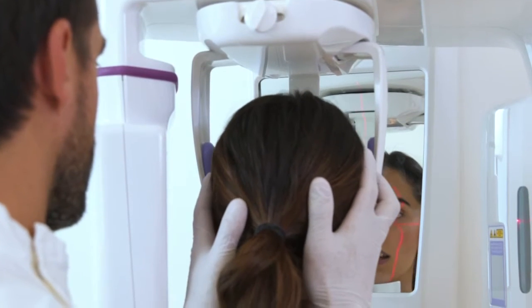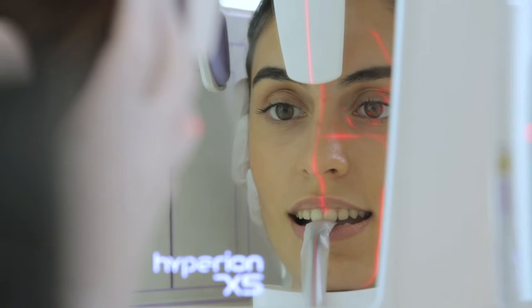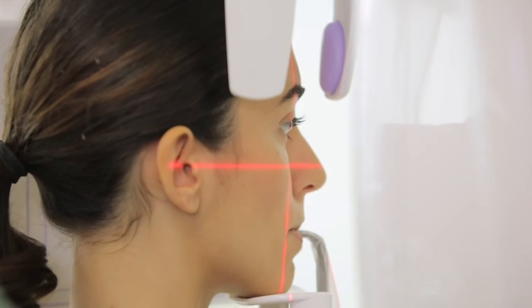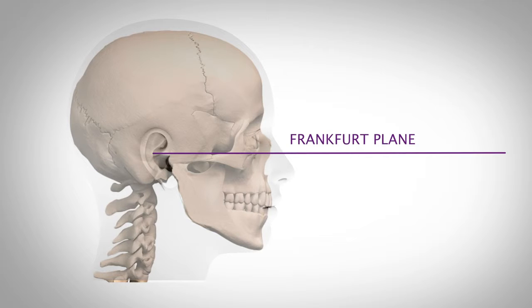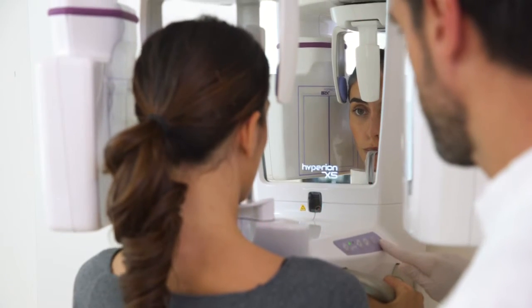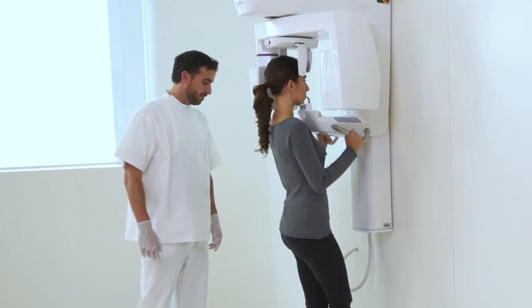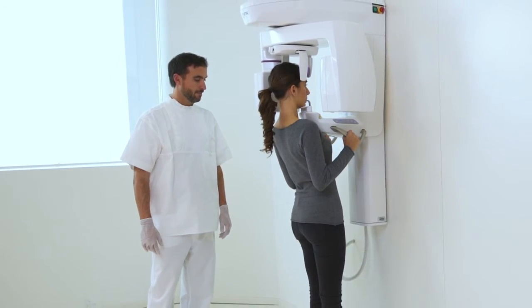Looking at the mirror and watching the vertical sagittal trace, facial symmetrical positioning can be improved. To adjust the head tilt angle and obtain the correct positioning of the Frankfurt plane, the dentist uses the up and down keys and the wheel to adjust the height of the laser. It is essential that the patient holds her back in an upright, straight position.